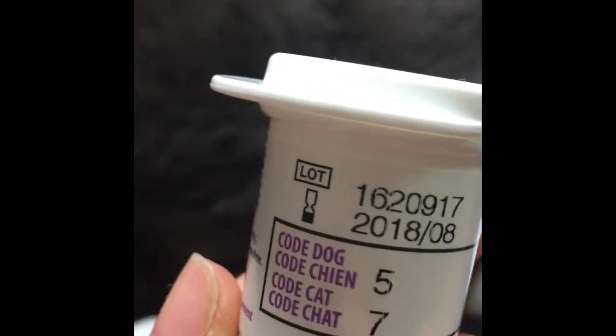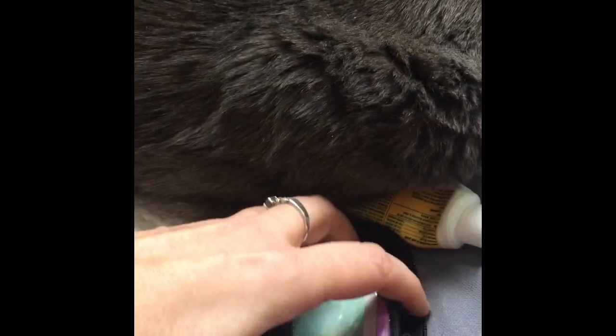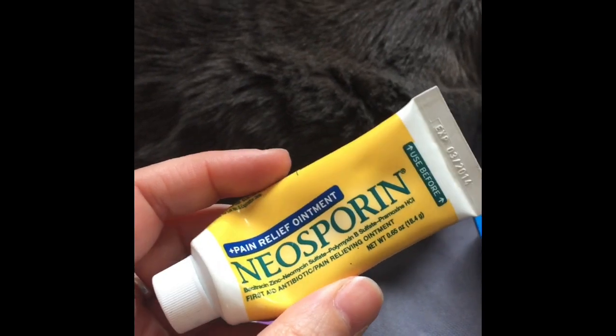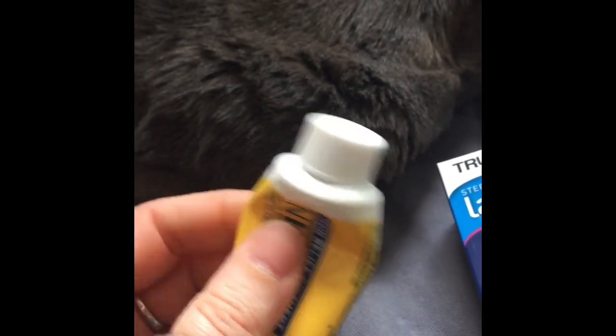In here I keep all my little lancets. I've also got a couple of little cotton rounds. And then my meter and the test strips. If you're using the AlphaTrac, the test strips have a little code on them — one's for a cat, one's for a dog. So make sure that you code your meter first, as each vial might be different. I also have in here some Neosporin ointment, because especially when you're testing several times a day, the Neosporin ointment with pain relief will just make them feel a little bit better and help the ear heal up.